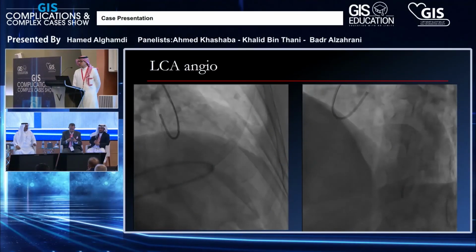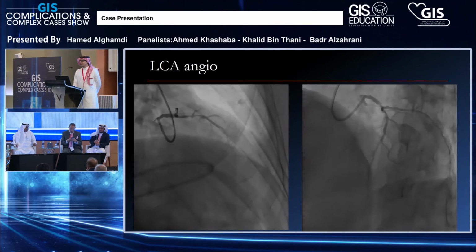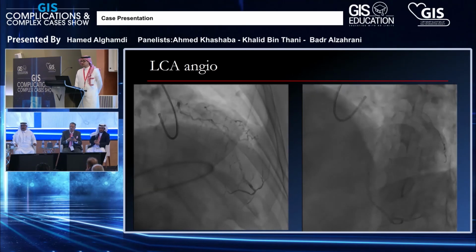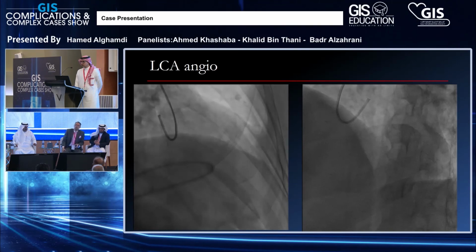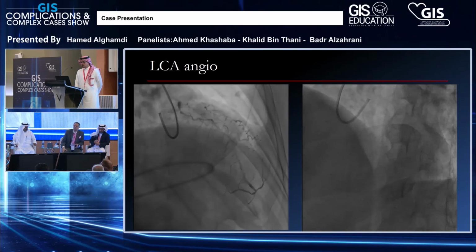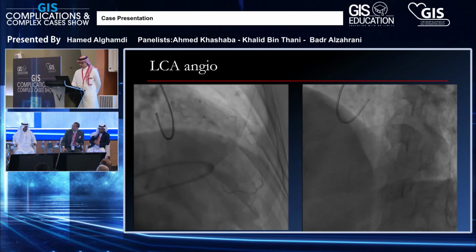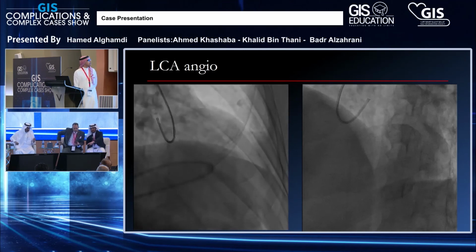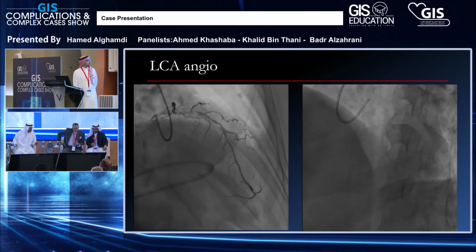I think the turning point in your case is when you decided to go for a full metal jacket. I think if you had done a hit and run, you might have gotten away with it. It's a difficult case. I commend your courage and your perseverance with it. You did everything possible, but these things happen. But I wanted to know, why did you decide to go for a full metal jacket? The lesion is not that long, and it would have been done with just stenting where that branch is coming off the left main.